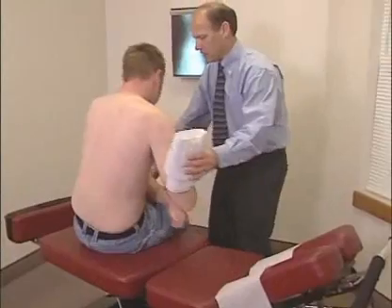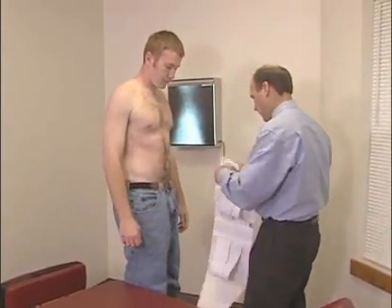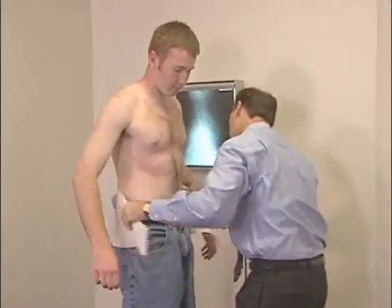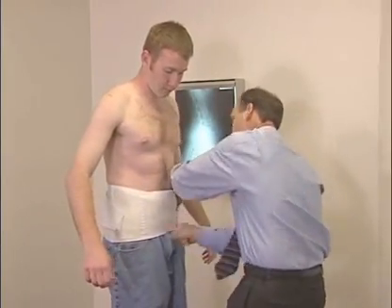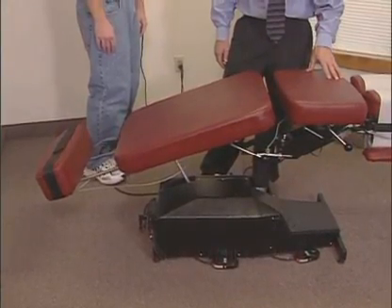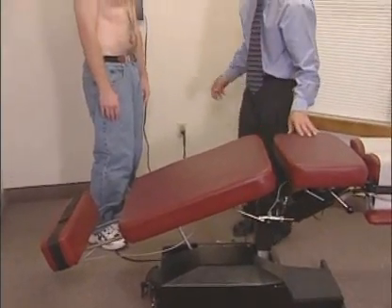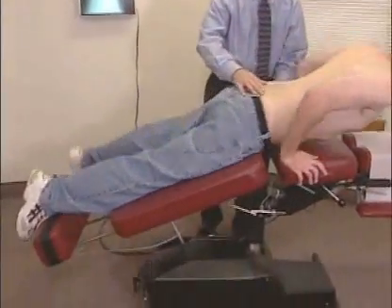Upon completion of therapy, have the patient slowly ascend from the table in a side position and apply bracing. Apply treatment twice daily or until the patient is standing straight and able to dismount the table without any sharp or jabbing pain. If you have a flexion distraction table with a variable height or uplift control, raise the top of the table as far as possible, keeping the pelvic section flexed down.